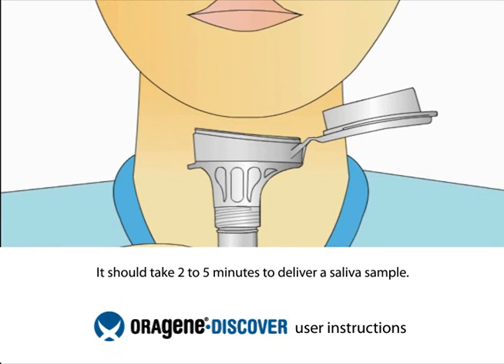Most people take between 2 and 5 minutes to deliver a saliva sample. Before spitting, relax and rub your cheeks gently for 30 seconds to create saliva.